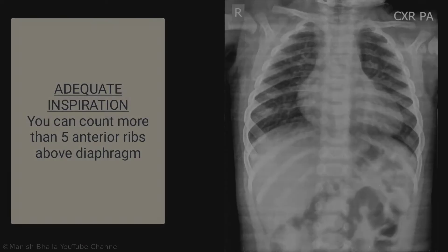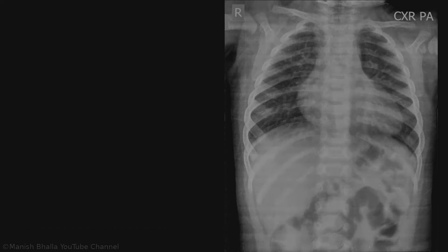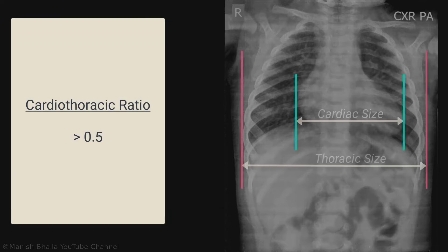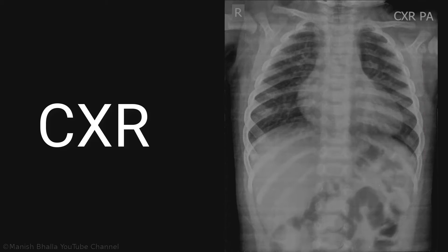This chest X-ray is taken in inspiration, slightly rotated to the left side, and is of adequate penetration. In this film, the heart is enlarged. If you observe carefully, you will note that the heart is boot-shaped. Boot-shaped heart, also known as coeur en sabot, is the description given to the appearance of the heart on plain chest X-ray film in some cases of Tetralogy of Fallot. It is the appearance of an upturned cardiac apex due to right ventricular hypertrophy and a concave pulmonary arterial segment, as you are seeing here.